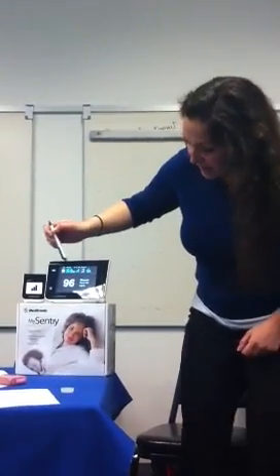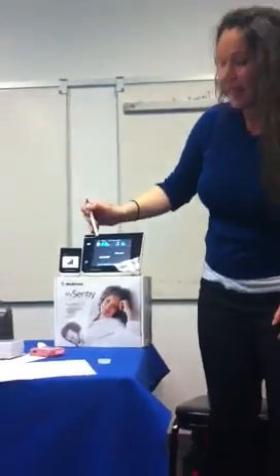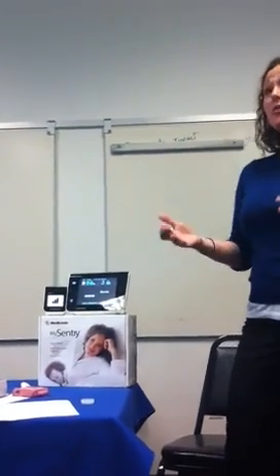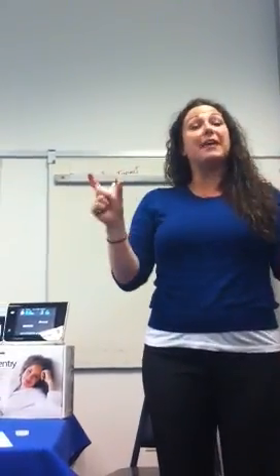And so as I said, this is your home screen, and you have a couple of things you can personalize on here too. You can personalize the image of the person being monitored, and then also put their initials. So say you had multiple people in your household that needed mySentries, or that you had mySentries. You could personalize to different likenesses. So you have this person and that person. You can actually personalize their initials as well, so that way you can say, oh, this is that person's and this is so-and-so's.